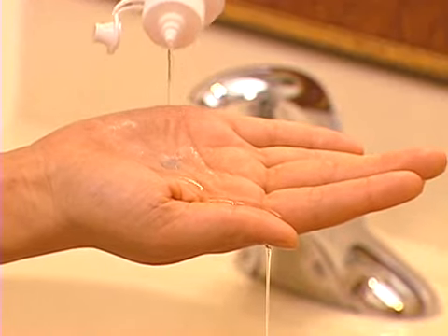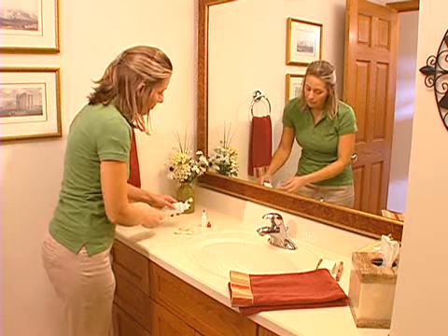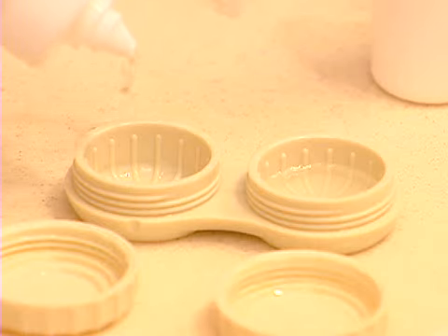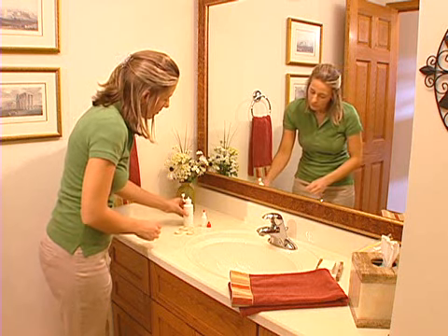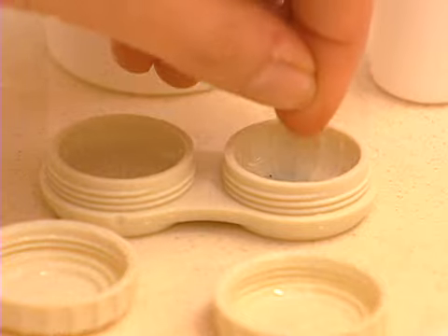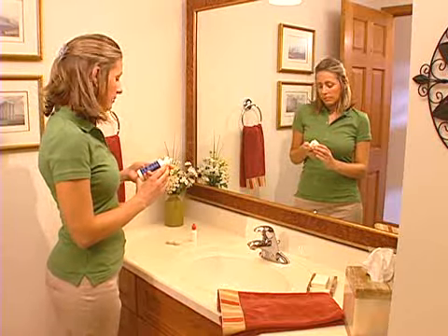The GP lens now needs to be stored. The solution that fills the case is designed to condition the surface of the lens and keep it safe during storage. It's imperative that fresh solution is used each and every time the GP lens is stored. Using old solution or topping off the solution can create an environment that's filled with bacteria. After filling the case with fresh conditioning or storage solution, simply store your GP lenses overnight.